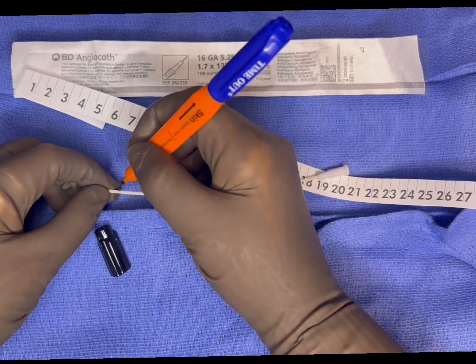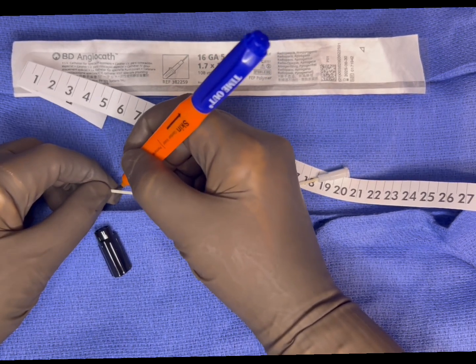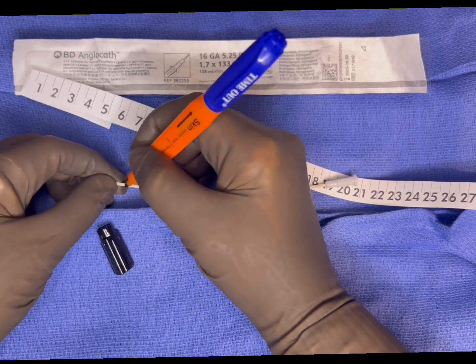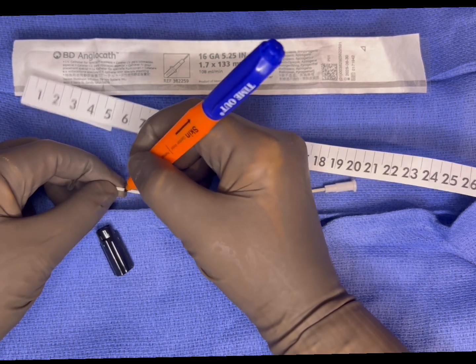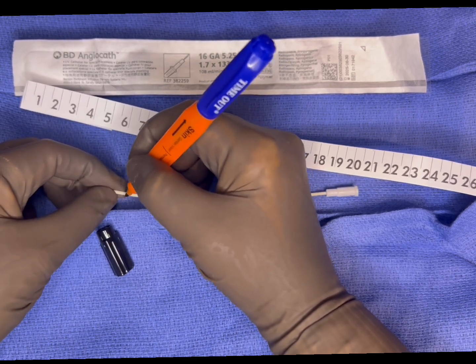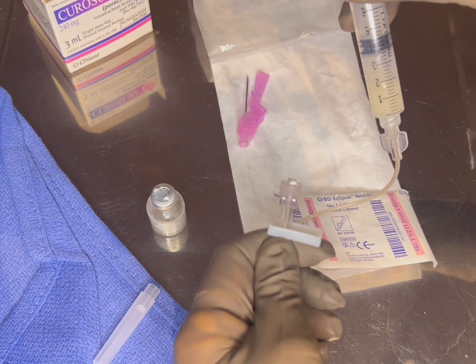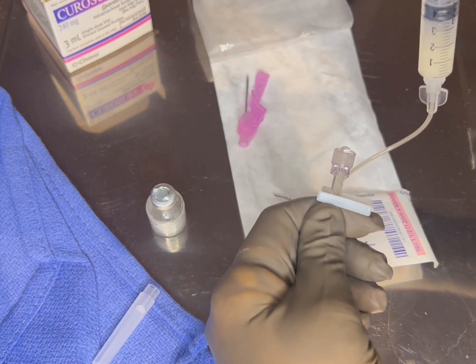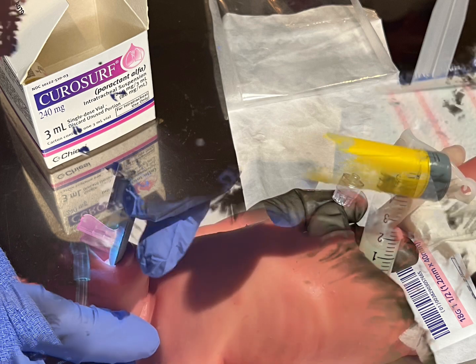Be sure to mark all the way around the catheter and make sure the mark is easily visible, as this measurement will be used as the point that passes through the vocal cords where you no longer advance the catheter further. You can also consider marking the line at the lip as well. While you are prepping the catheter, the RT or RN can use the 5 ml syringe and an 18-gauge needle to draw up the correct dose of surfactant, plus 1 ml of air, to ensure the entire dose is delivered.